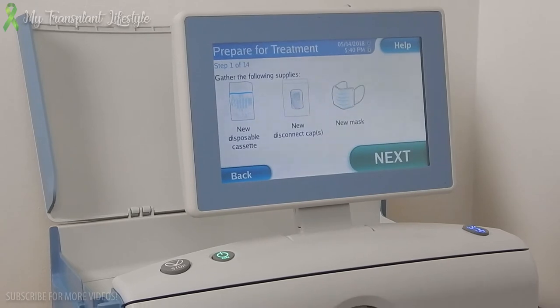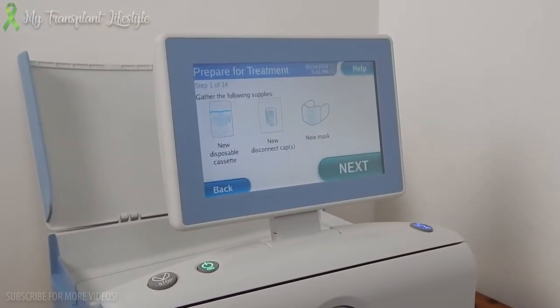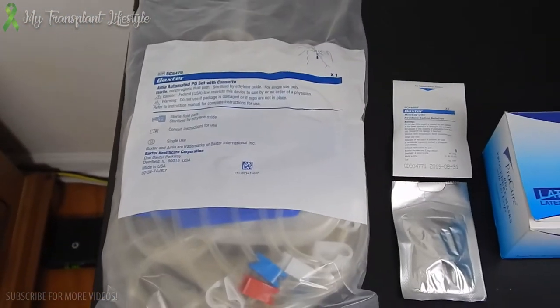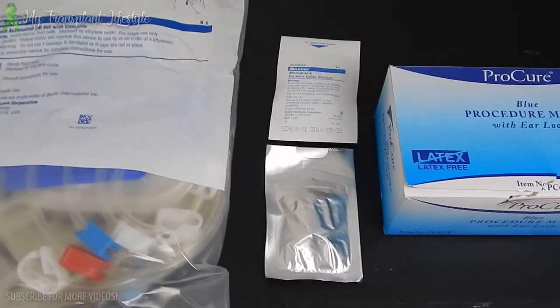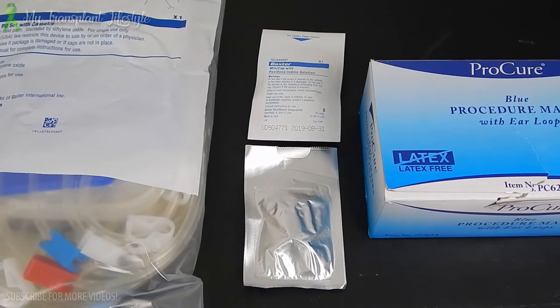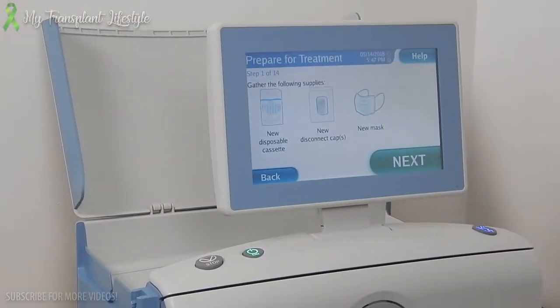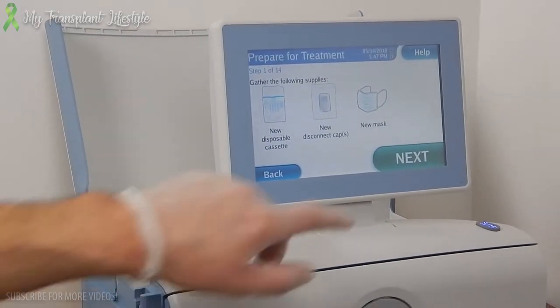Gather your treatment supplies according to your program. Items you'll need in order to prepare for your treatment. You will need a disposable cassette, 2 disconnect caps, as well as a mask. Once you gather all your supplies, hit next.